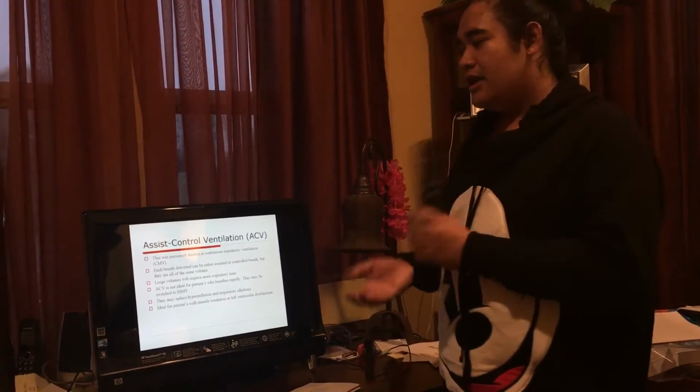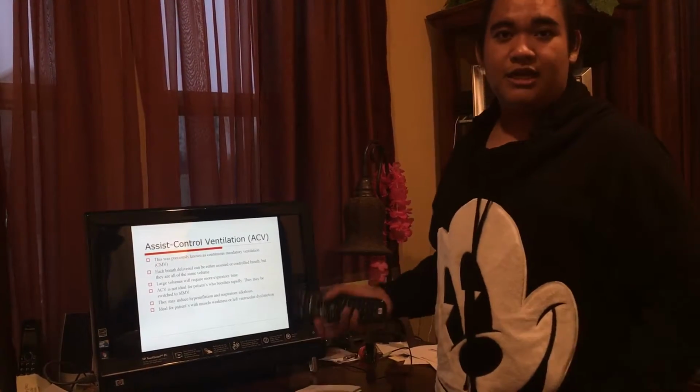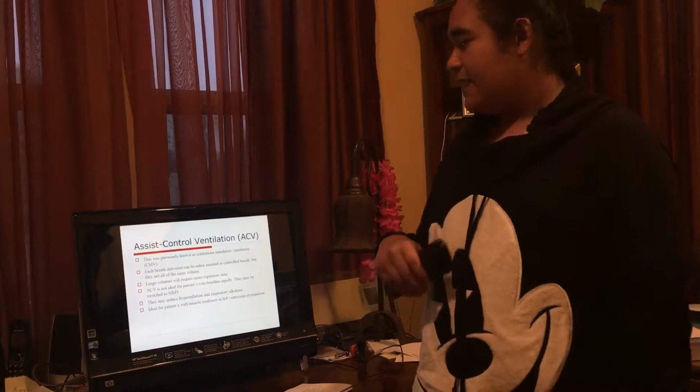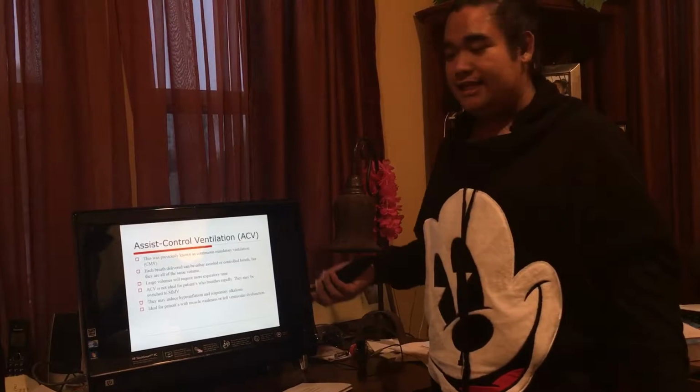All of those breaths will have the same volume. Every breath will have, let's say, 225 mLs, as an example. That will not vary. It's going to be constant. It's a volume guarantee, in a sense.